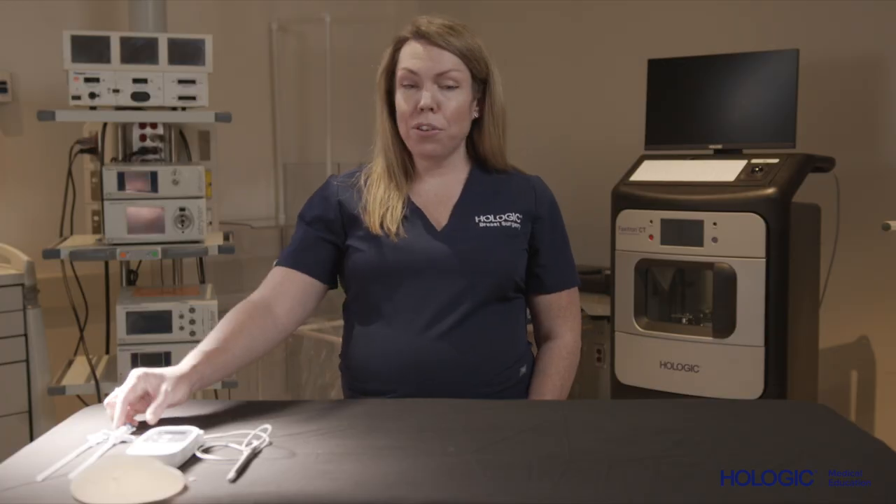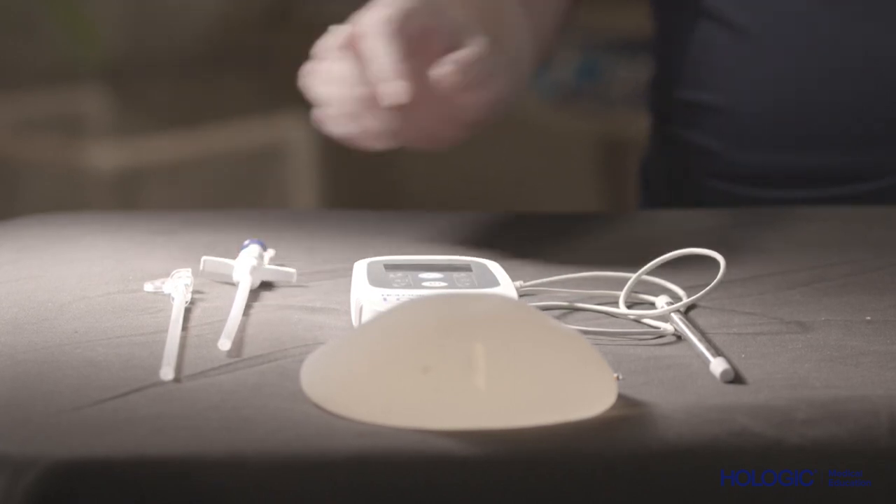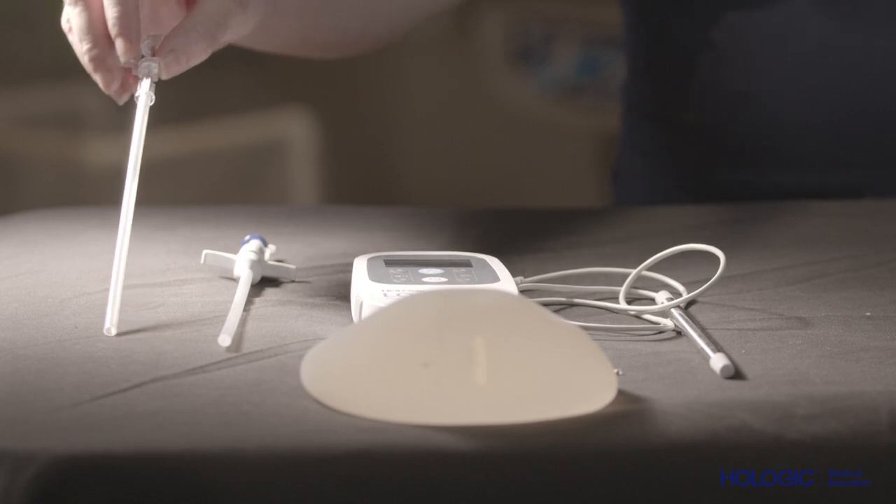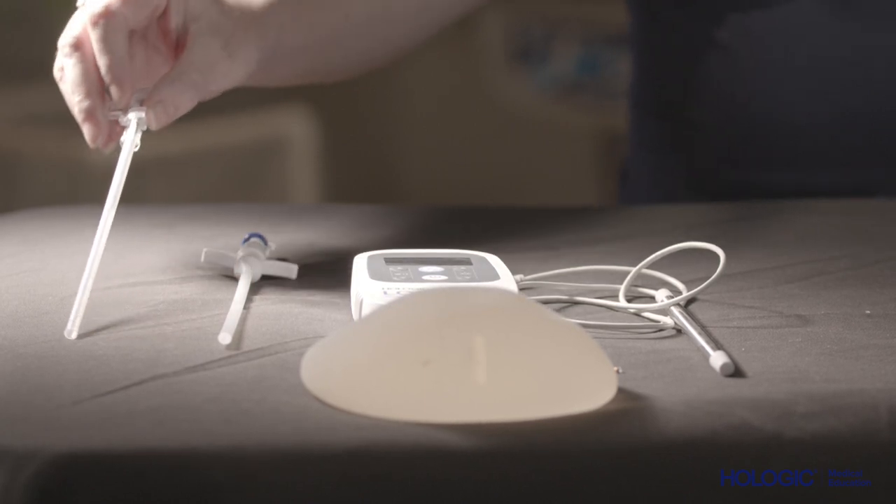The original needle applicator was designed with ultrasound placement in mind, while the S needle applicator was designed to optimize X-ray and stereotactic placement.